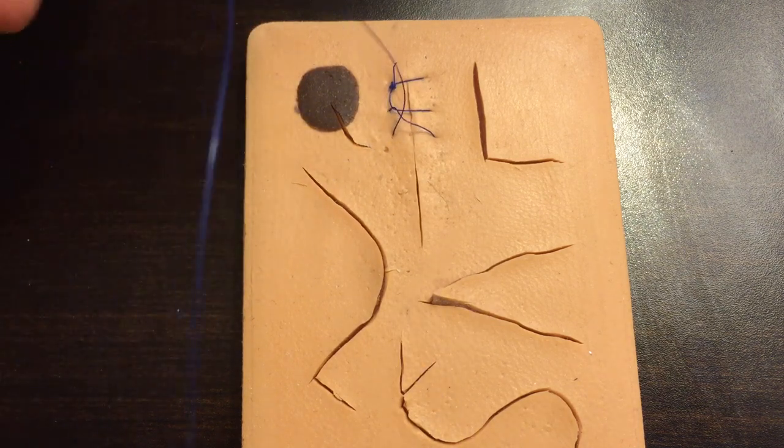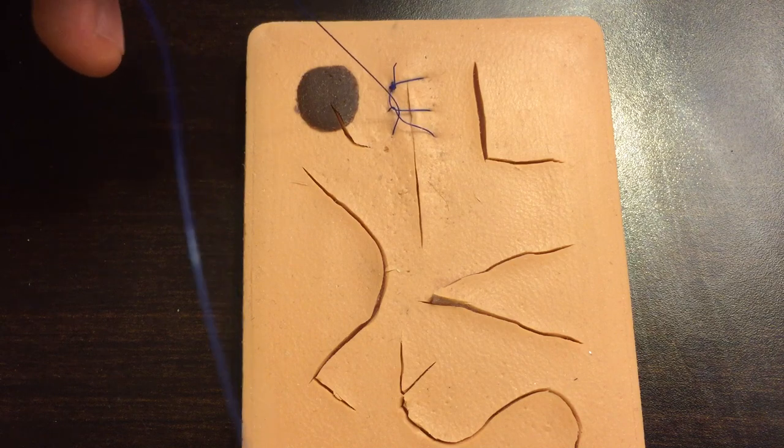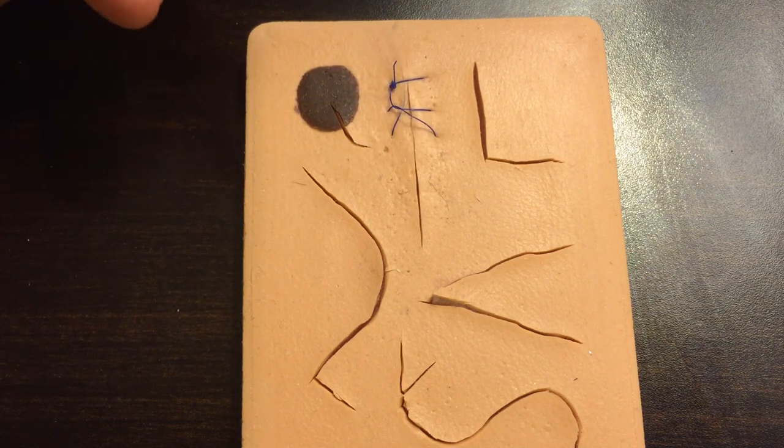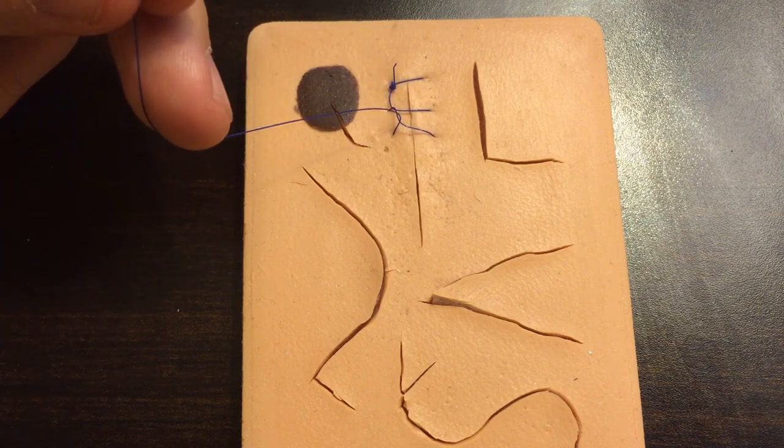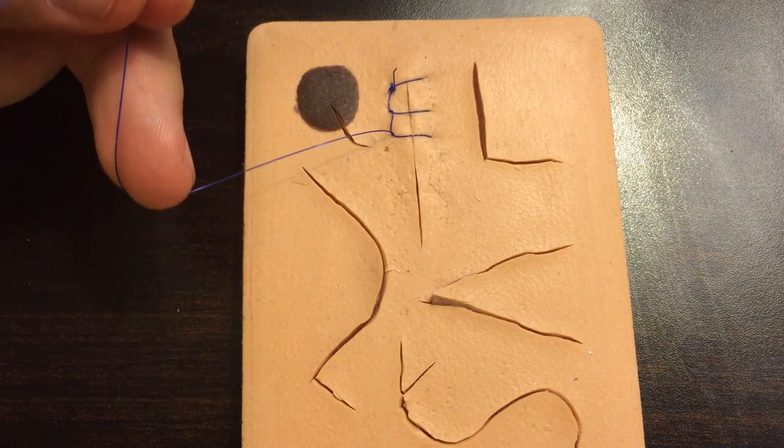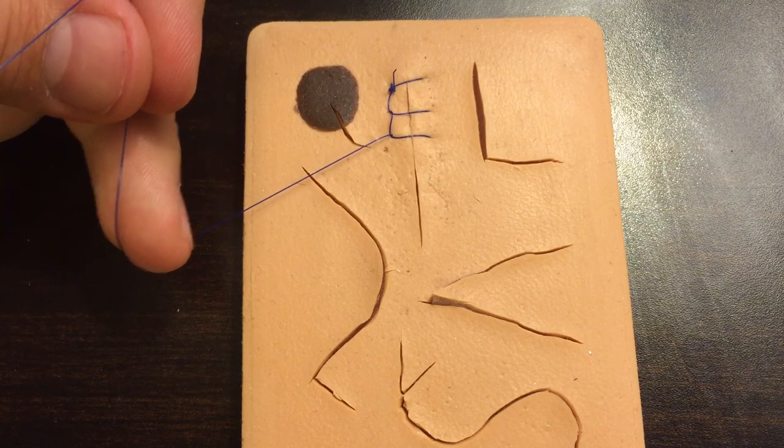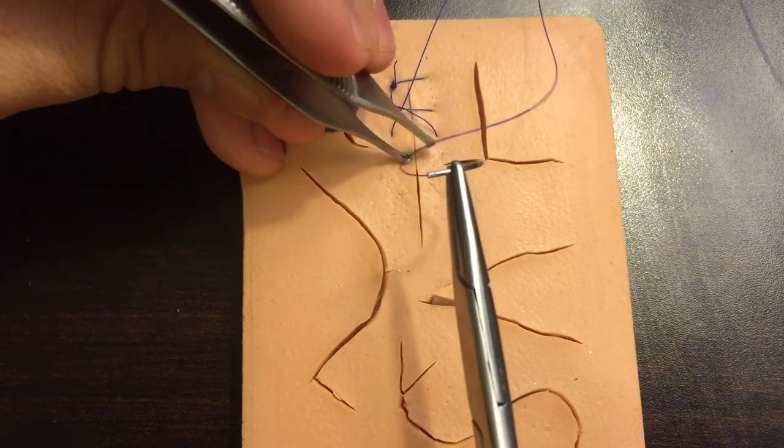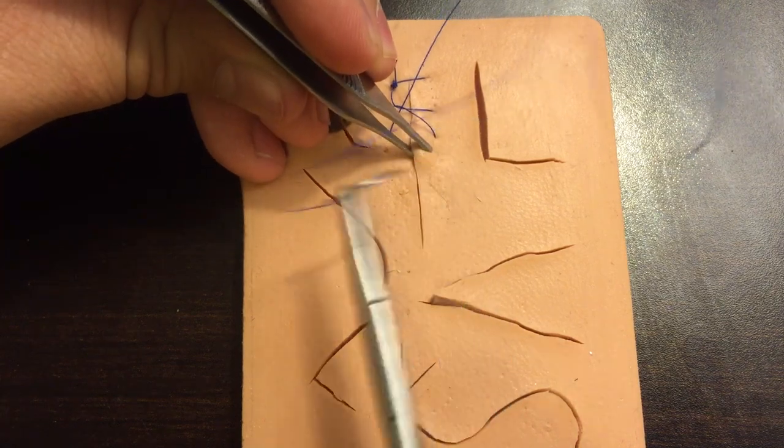Now, if you have another person helping you, for example, if you're in the operating room doing this, you might have a scrub tech or a nurse or another provider that can do what's called follow. Now they might follow by holding this tight for you while you throw the next throw. And that's nice because it just keeps it snug as you go, but when you're working by yourself, you got to let it loosen up a little bit.